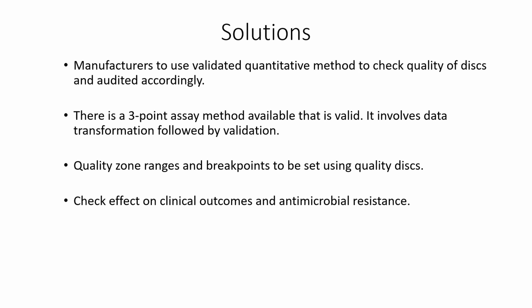The quality zone ranges and breakpoints should be set using only quality discs. That means discs that are known to be in spec, and then the effect on clinical outcomes and antimicrobial resistance should be looked into using only proper high quality discs.